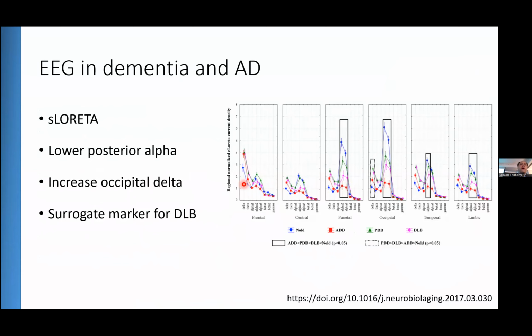You see, when we are analyzing the EEG, for example, if we have a patient with epilepsy, it's enough that we analyze it by eye. It's a visual inspection, and you need a trained neurologist or neurophysiologist who can read EEG. Usually it takes a few months to learn that and get acquainted, and then several years to get practice. The more EEG you see, the better you are. But when we are talking about the EEG in dementia, unfortunately, we need to use some other tools.